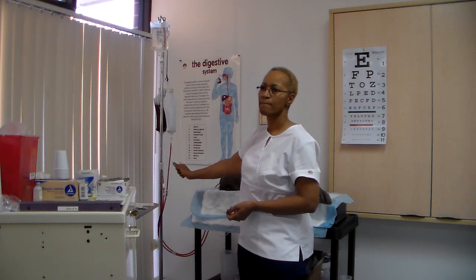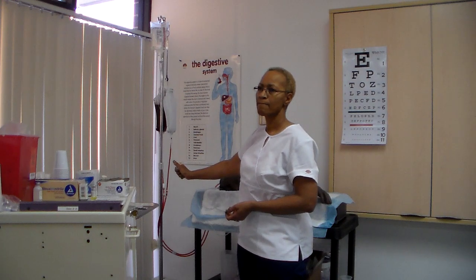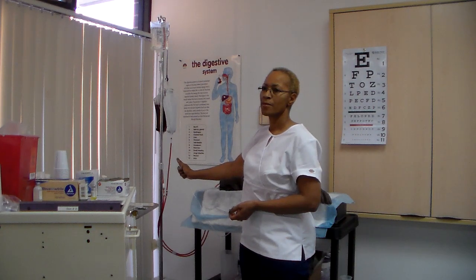Prepare vented IV bottle or plastic bag. Check volume of solution remaining in bottle or bag. Close off IV infusion clamp. Wipe off medication port with an alcohol or antiseptic swab. Remove needle cap or sheath from syringe. Insert syringe needle or needleless device through injection port and inject medication.